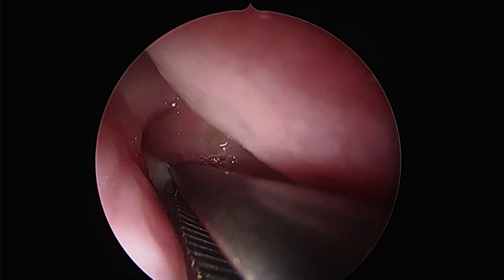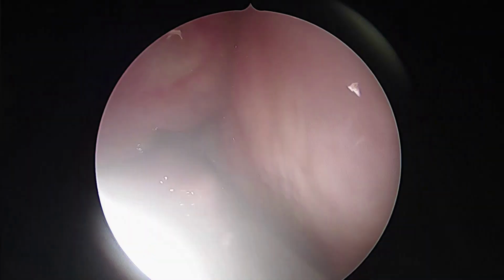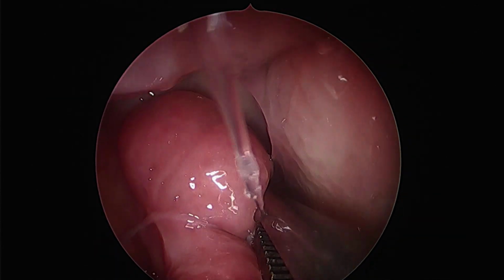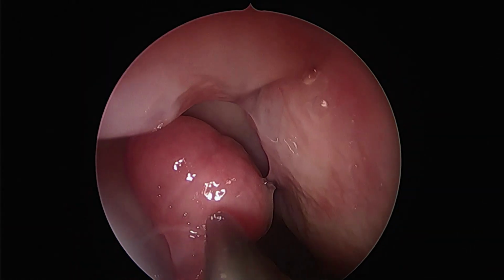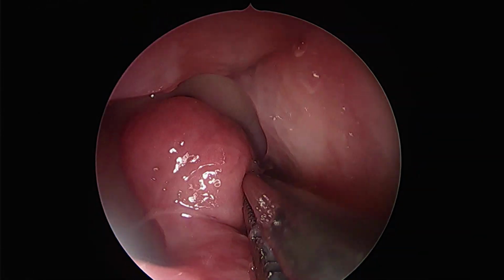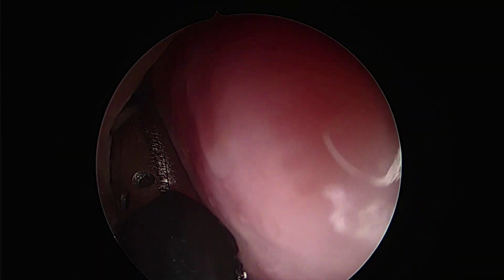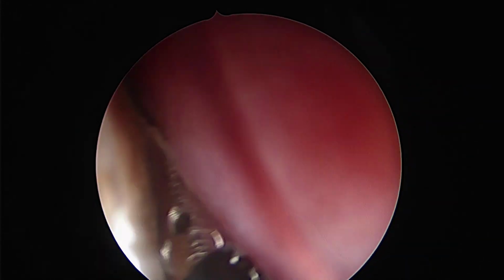So this is a patient who was previously operated 2 years prior, and has presented again with nasal obstruction and severe symptoms. This is the endoscopy after a thorough preparation, post 7 days of antibiotics and steroids. What we now see is a rather nicely clear opening, a large antrostomy, some thickened soft tissue over the posterior wall of the antrum, and synechiae, as well as a very large polypoidal and hypertrophic middle turbinate.